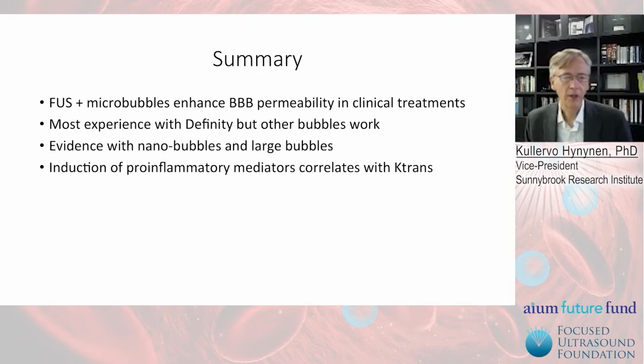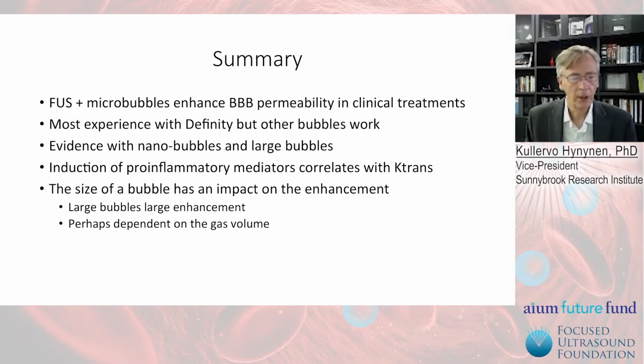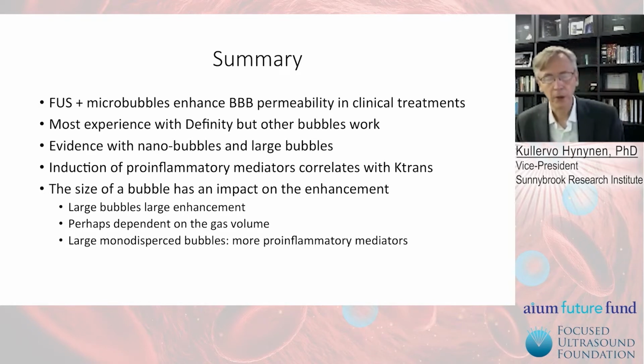There seems to be induction of pro-inflammatory mediators that correlate with K-trans, and the bubble size seems to have an impact on the enhancement. Larger bubbles seem to enhance more, and this might depend on gas volume. And large monodisperse bubbles might be more effective in enhancing pro-inflammatory mediators.